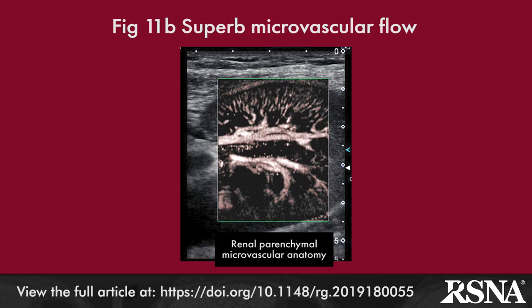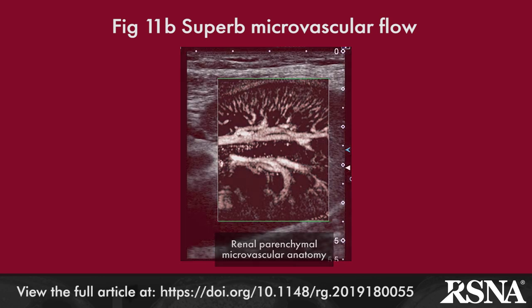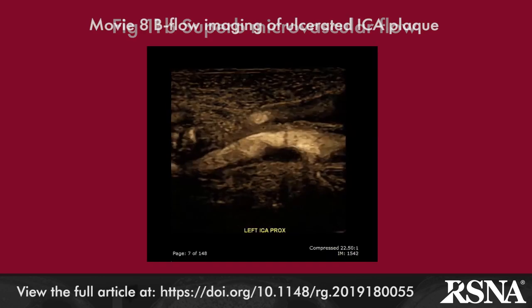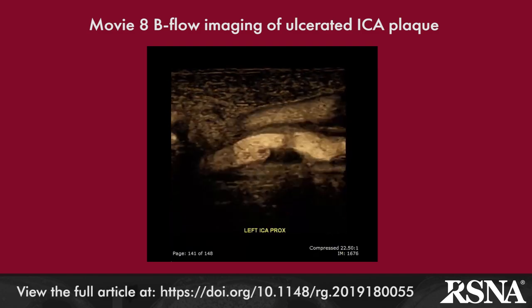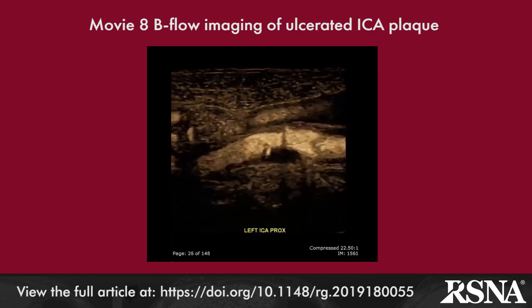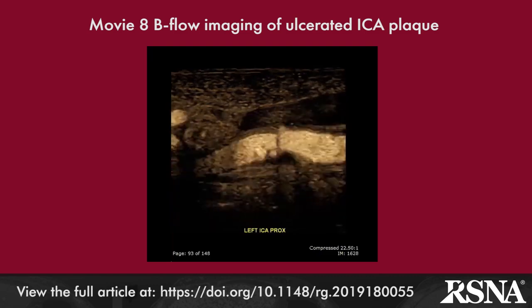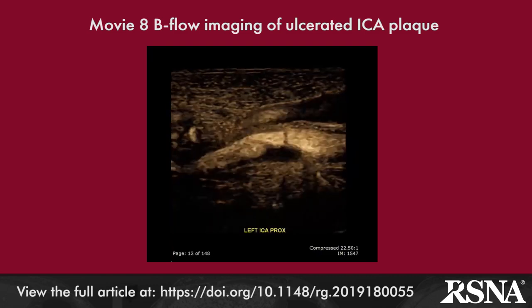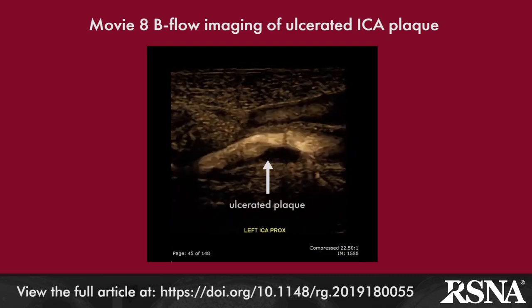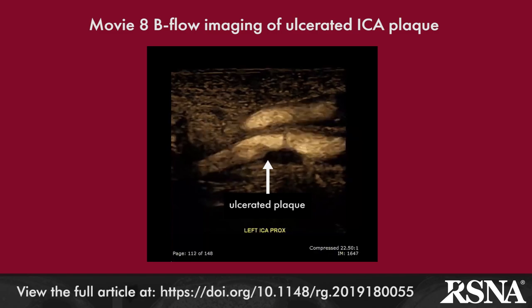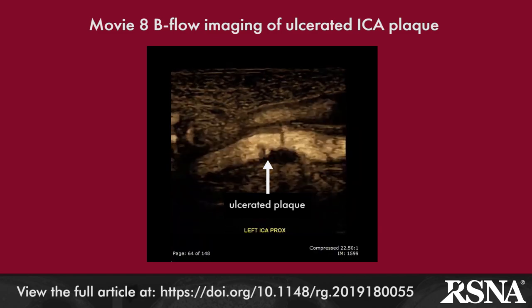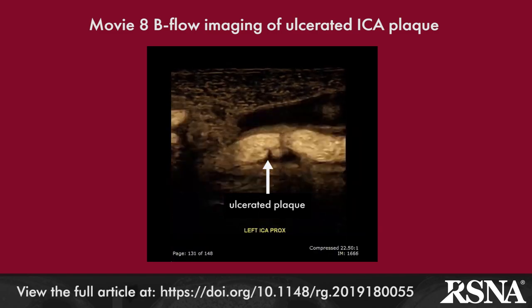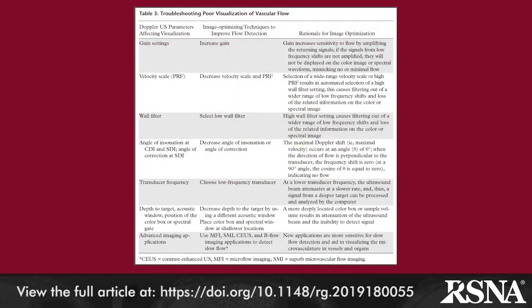Figures 11 and 12 and Movie 8 illustrate some of these techniques. B-flow imaging of the left internal carotid artery demonstrates intermediate blood flow within a small ulceration of the soft plaque. Dissection is also noted at the site of the internal carotid artery. This was not seen on color Doppler imaging due to blooming artifact and low sensitivity to slow flow.